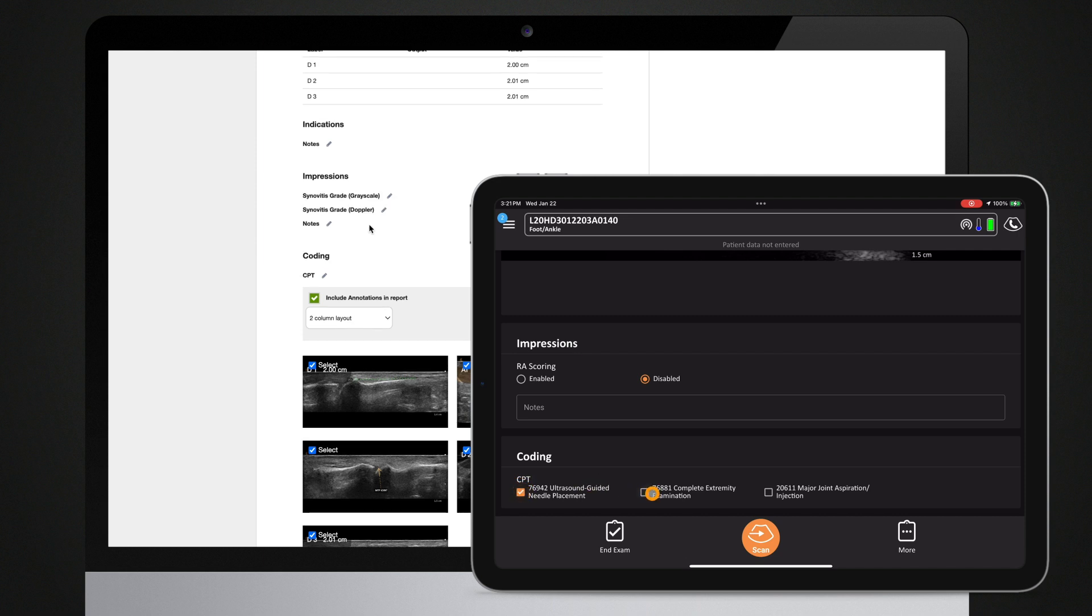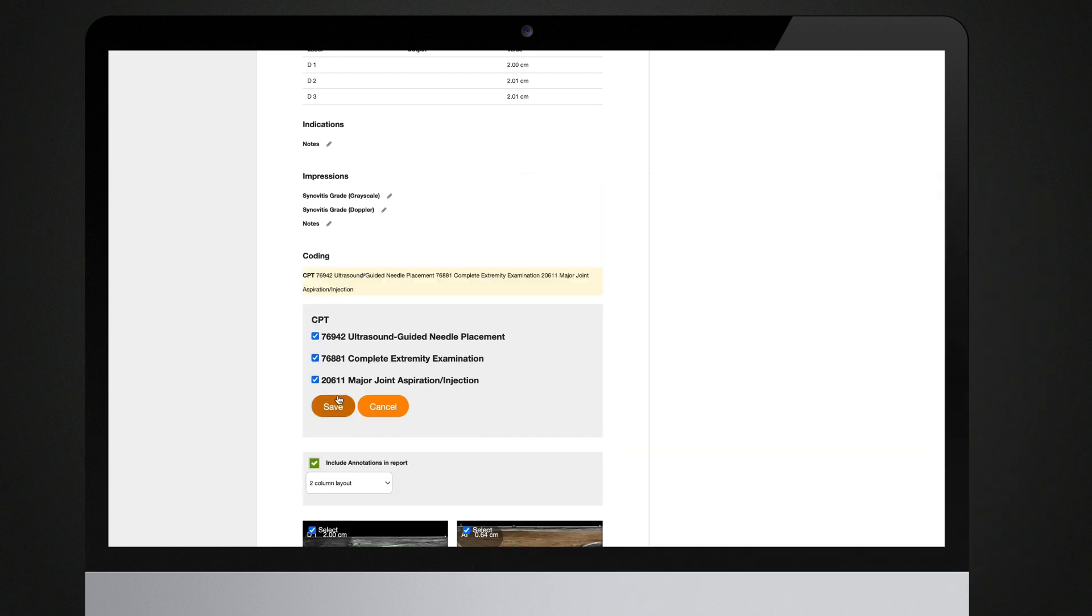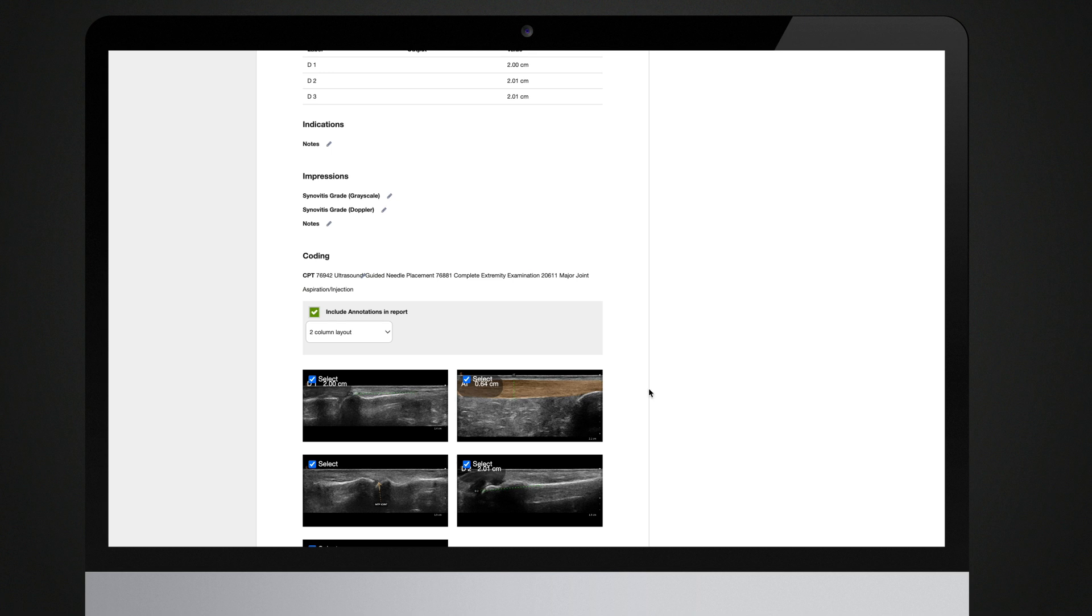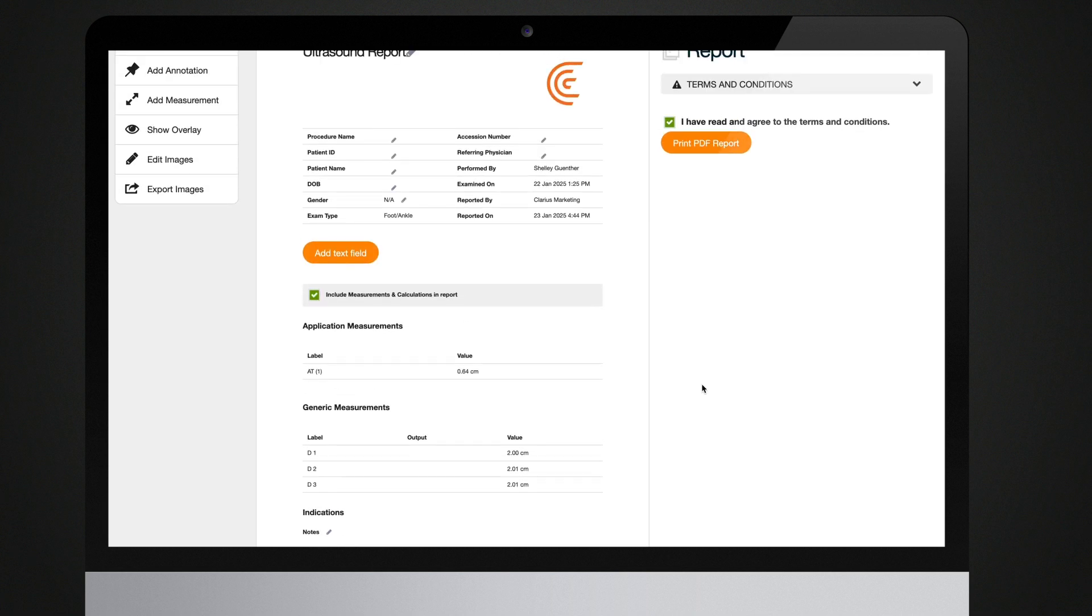Clinicians in the United States will be able to access and choose relevant point of care CPT codes from the Clarius app while using any Clarius scanner. The CPT code can be added to the PDF report on the Clarius Cloud to streamline billing.